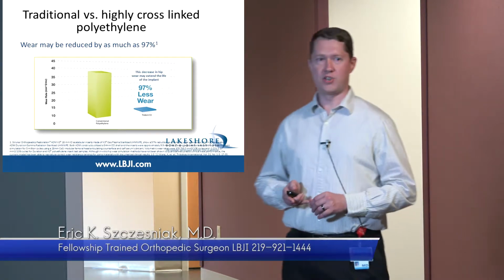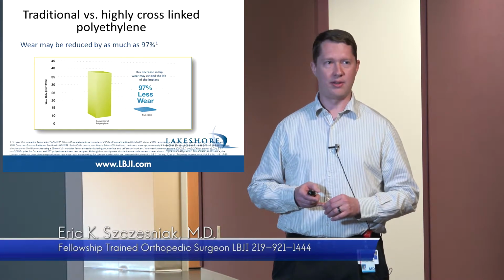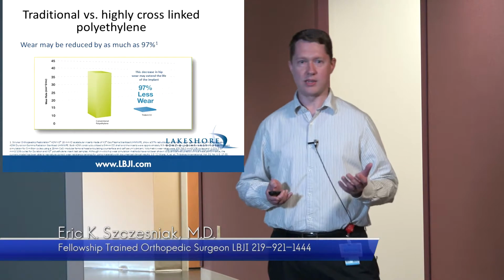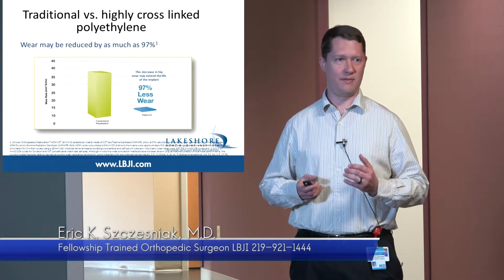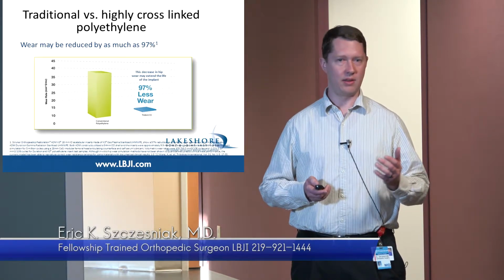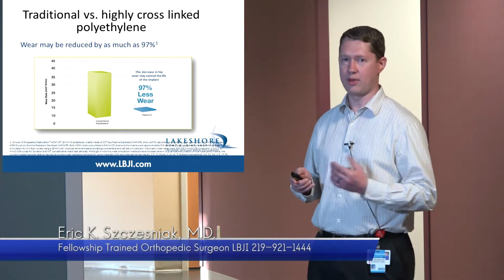The other thing we've done is we've changed the way the plastic is processed. It's actually the same plastic, but it's processed differently. And in the laboratory, it resulted in an over 90% reduction in the wear rate. Now that change was made about 15 years ago. I told you that we quote about 20 years for a hip replacement. So if that change was made 15 years ago, we're still waiting to make sure that makes a difference in actual real live use, but it would seem that hip replacements are going to last even longer than 20 years now, given the laboratory data about how much slower they wear with this new change in the plastic.